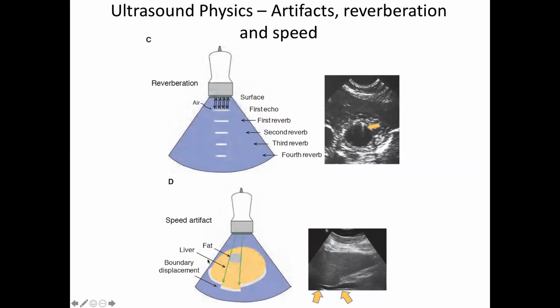And then here, where you have a large change in Z value, oh no, actually a large change in speed of sound, not Z value. Your assumption is that the speed of sound is constant along here, but if there's a big chunk that has quite a different speed of sound, it will just shift everything in space because the times will shift.